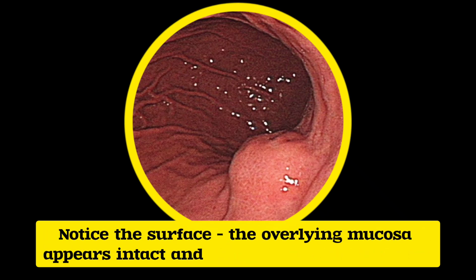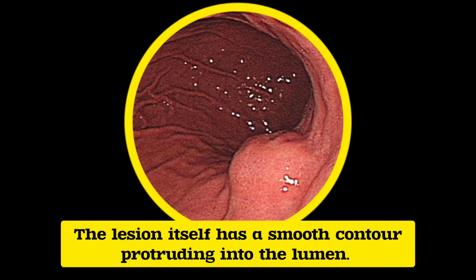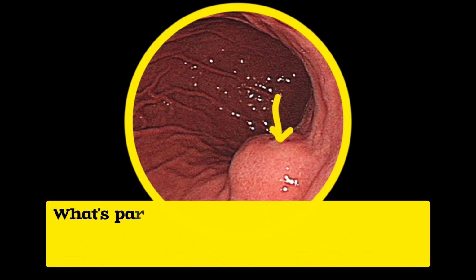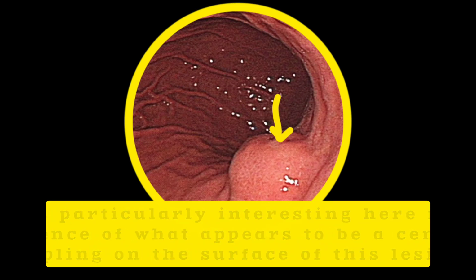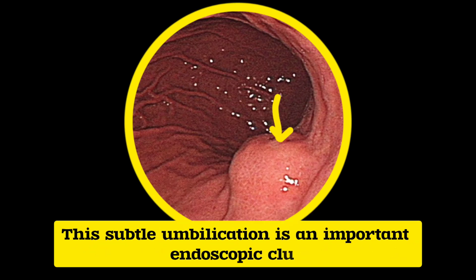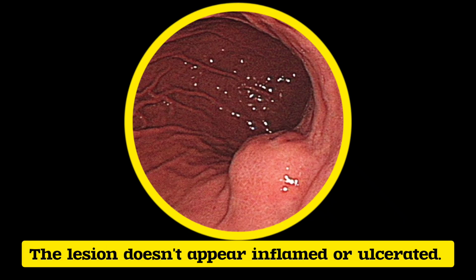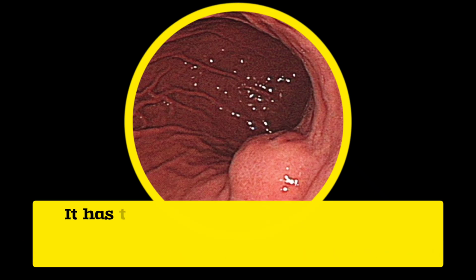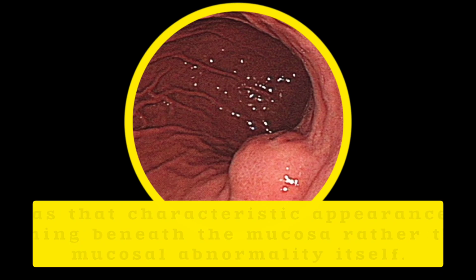Notice the surface. The overlying mucosa appears intact and relatively normal in color. The lesion itself has a smooth contour protruding into the lumen. What's particularly interesting here is the presence of what appears to be a central dimpling on the surface of this lesion. This subtle umbilication is an important endoscopic clue. The lesion doesn't appear inflamed or ulcerated. It has that characteristic appearance of something beneath the mucosa rather than a mucosal abnormality itself.